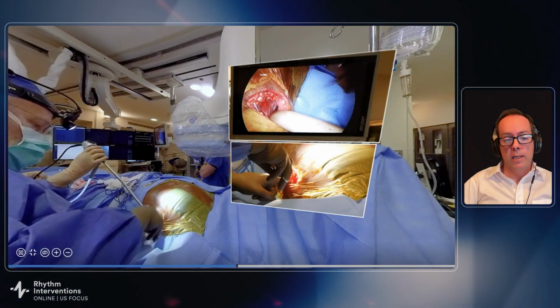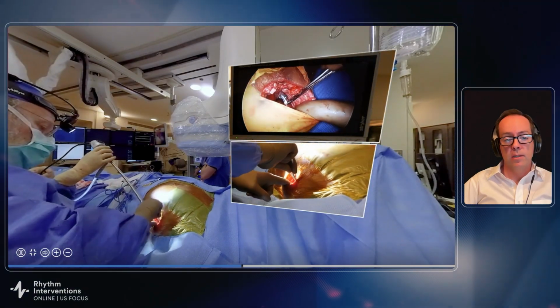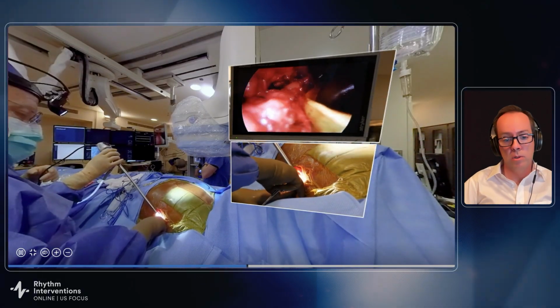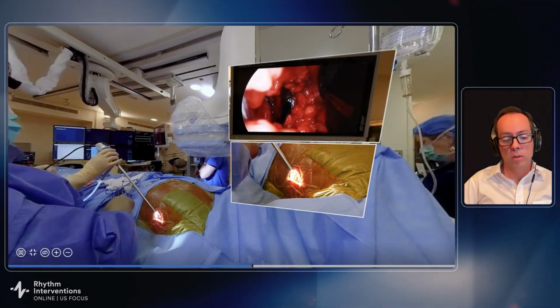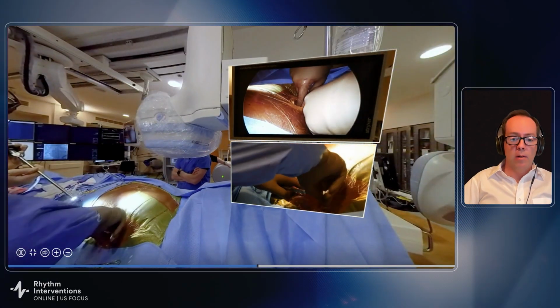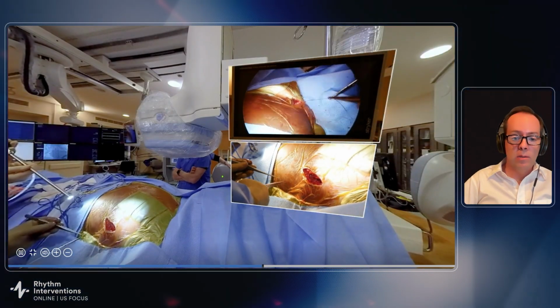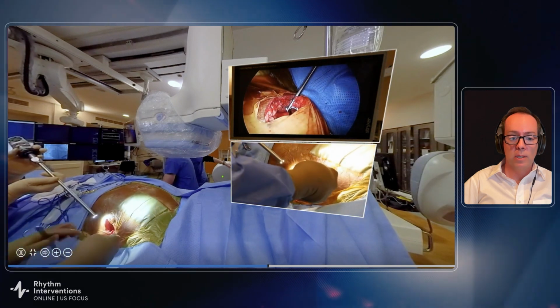We rinse the pocket heavily. He's introduced the device inside. He doesn't use anchoring. I also don't use anchoring suture. And now he's ready for the all-important closure. Now, for me, closure is like a coeliotomy. I want this thing to be robust.